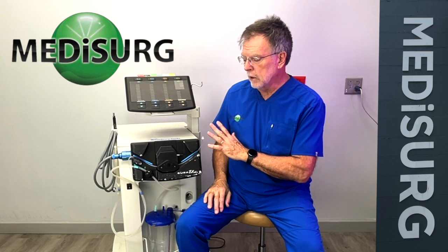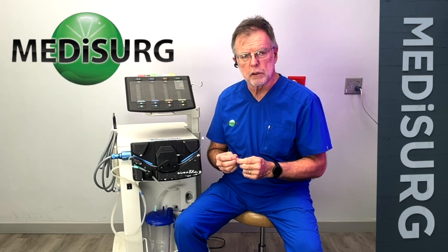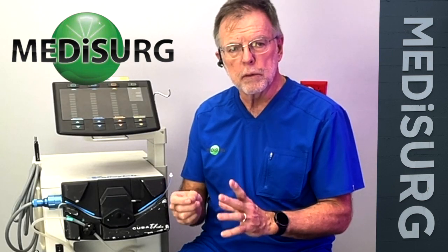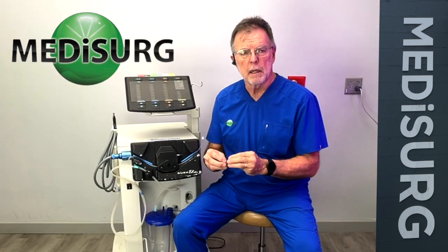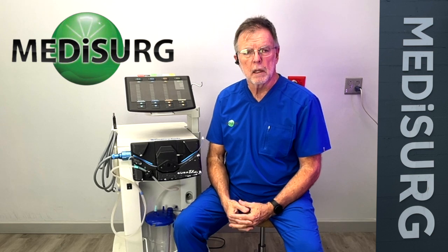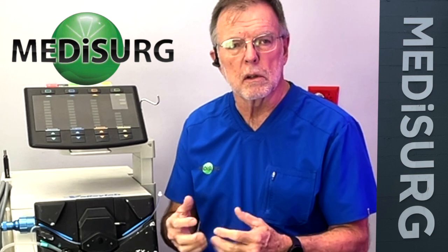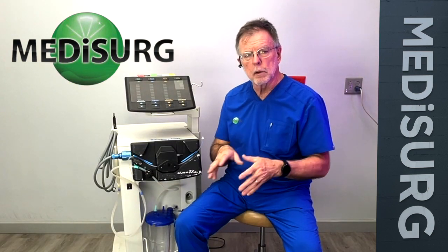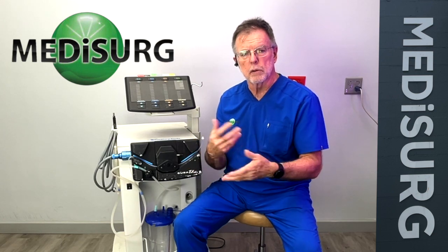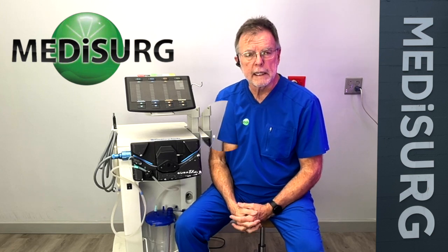This system is designed so that the surgeon can do minimally invasive surgery with a needle that goes inside the body to remove a tumor through suction. The tip actually oscillates and vibrates, cuts up and emulsifies the tissue — a tumor or whatever it might be — and then sucks all the disrupted material out of the body. It also has a bottle that hangs on here to give irrigation into the body, providing constant flow to remove the tumor with great ease.